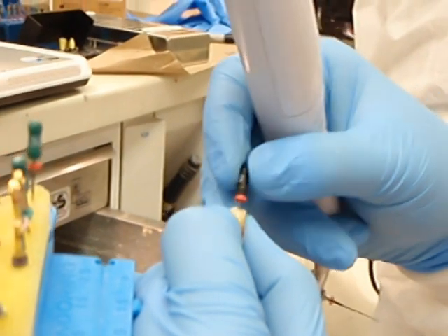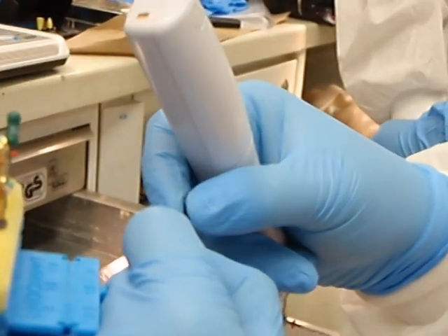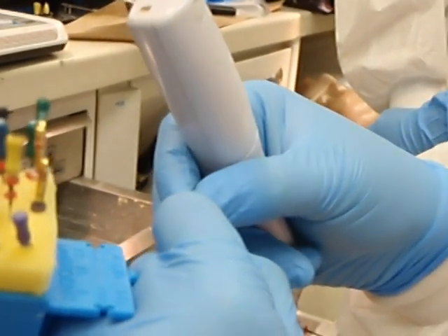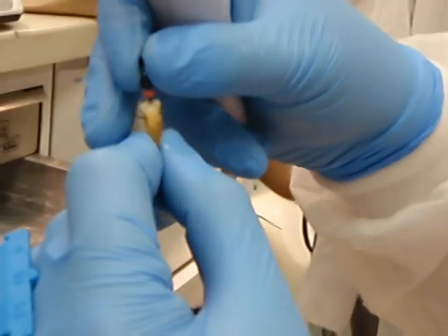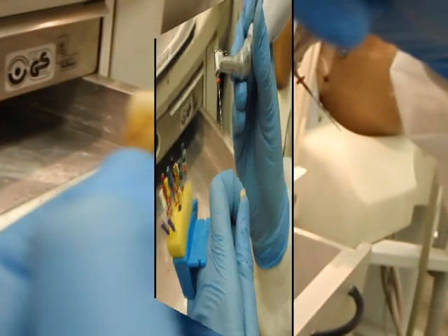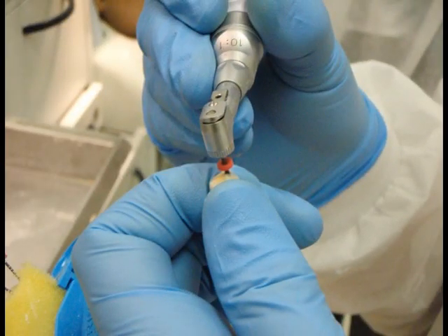The goal of this exercise is to place a size 45 master apical file to working length. A master apical file size of 45 is the desired diameter for an endodontically treated mandibular canine at the University of Tennessee. Continue shaping until a size 45 file fits to working length.